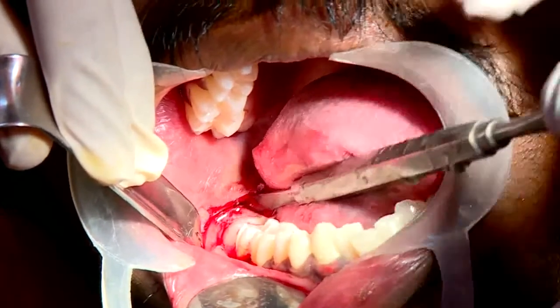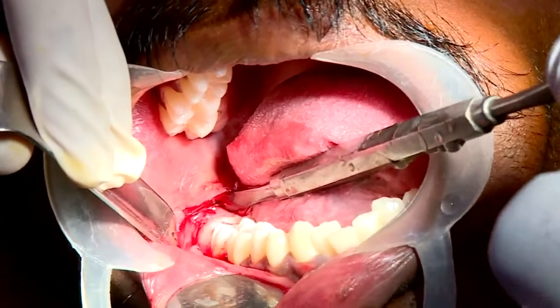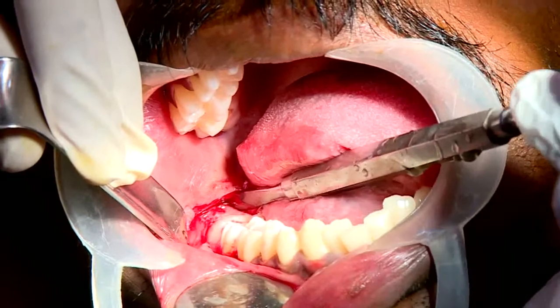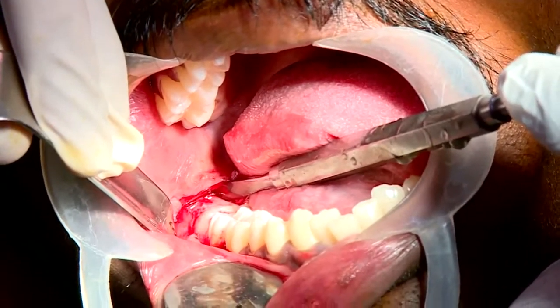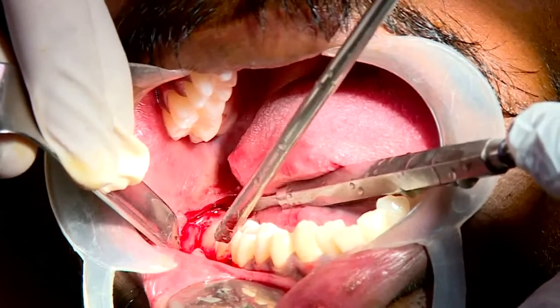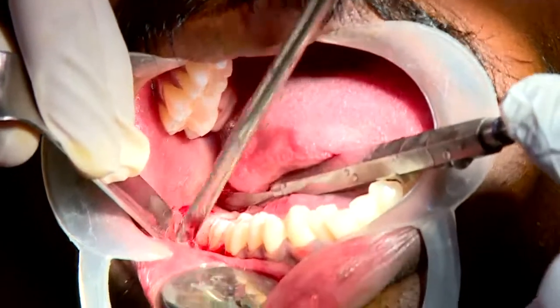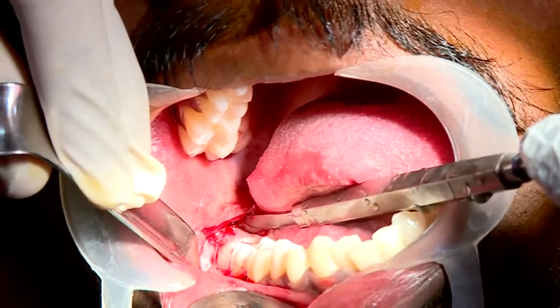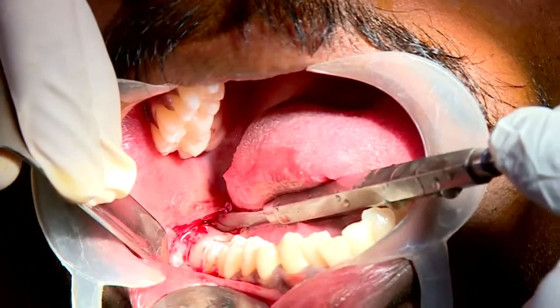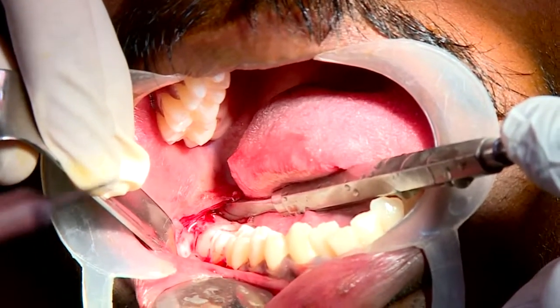The bone guttering procedure should not exceed 47 degrees Celsius, because whenever I am using a burr for cutting bone, it may cause thermal necrosis. So I need copious irrigation of saline to avoid producing exothermic heat. That's very important.